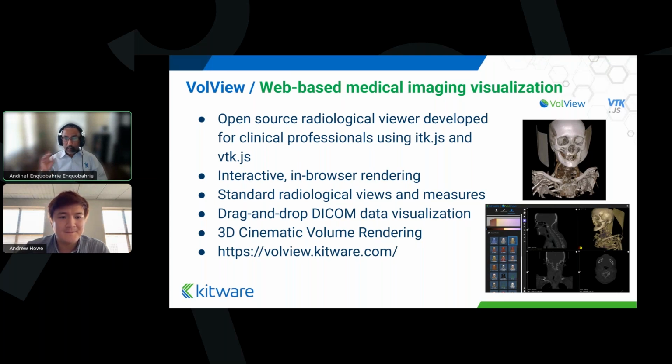Now we do have another platform called TRAME, which provides client-server side rendering. In some cases, if your input data is very, very large, and having the 3D rendering in the browser on your workstation becomes really resource intensive, then you can think about using TRAME for doing server-side rendering.